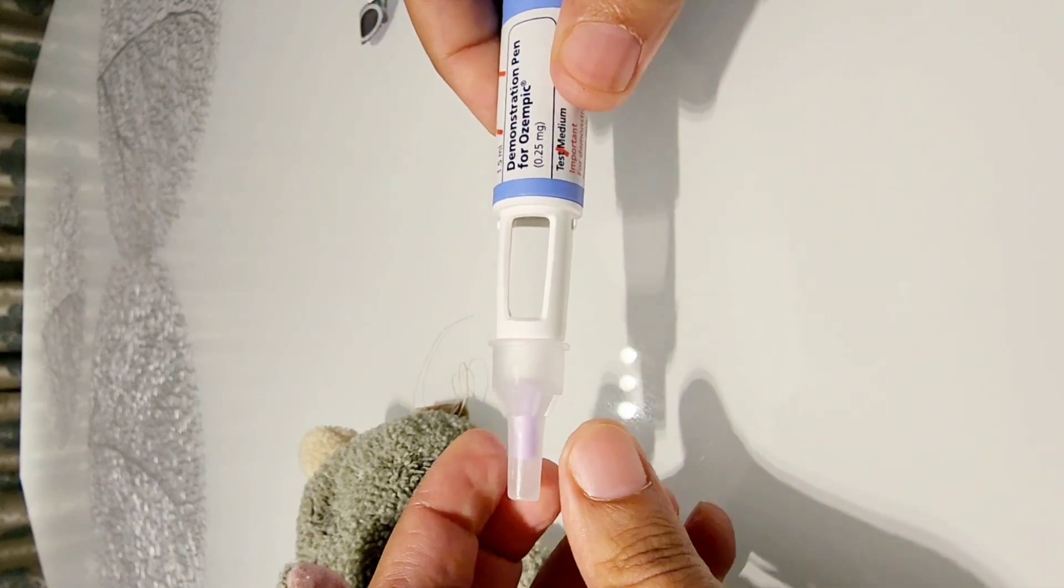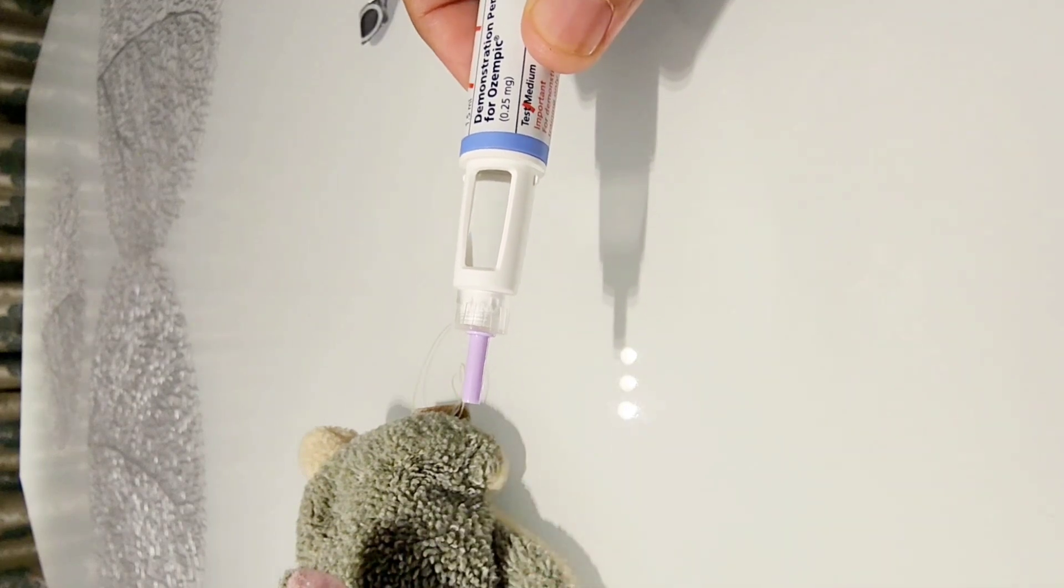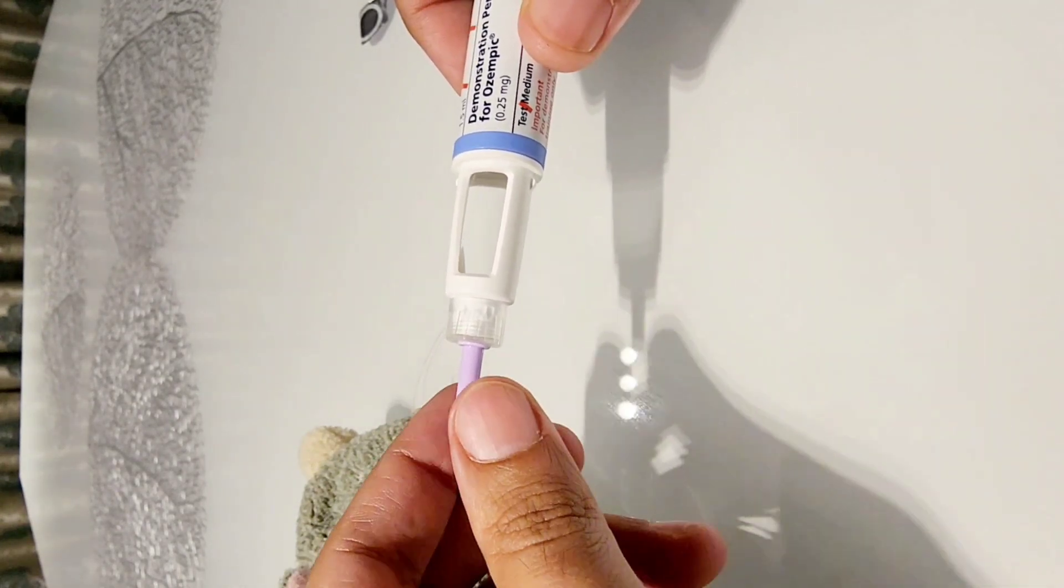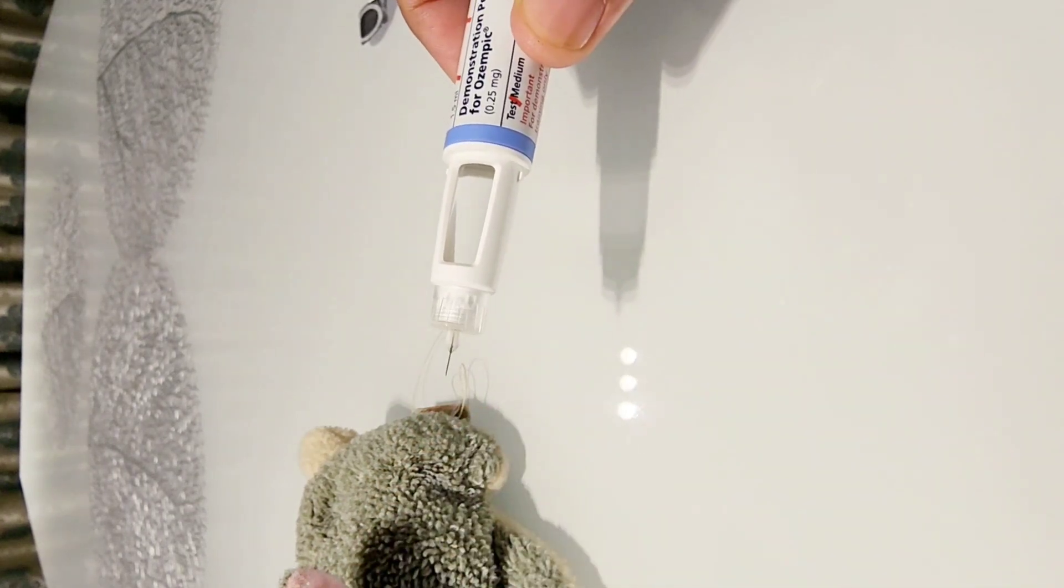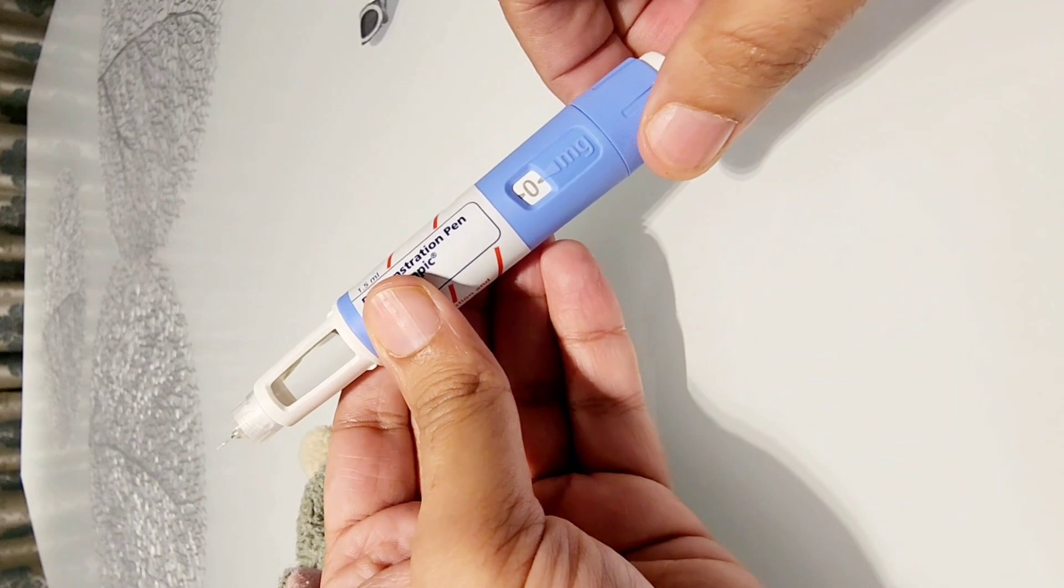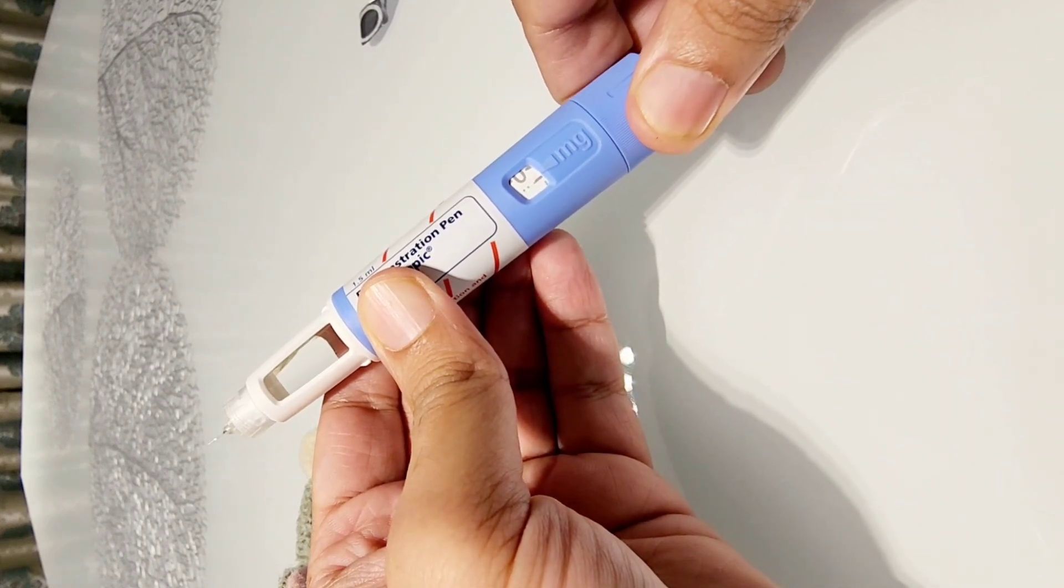Now once it has been nicely screwed we remove this needle. This is the first cap and then there is a protective sheet. Now it is usually advisable that you test the device as well which is to make sure that the needle is working.